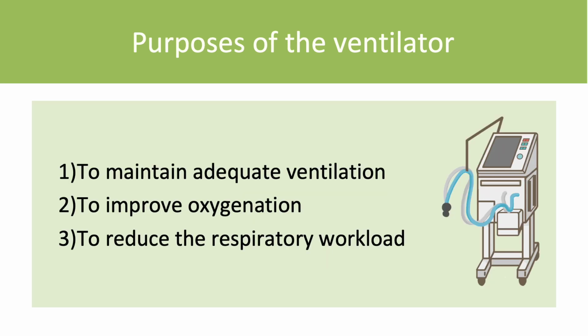There are three main purposes of the ventilator: to maintain adequate ventilation, improve oxygenation, and reduce respiratory workload. If mechanical ventilation is indicated, it means that one or more of these three things cannot be maintained by the patient's own breathing. Let's go over the details one by one.